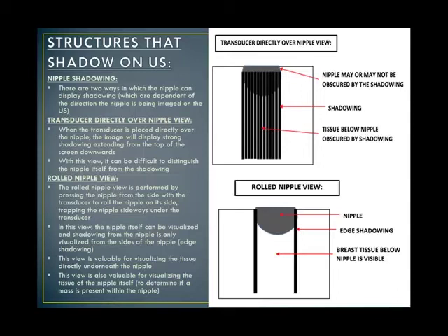So it's always tricky to get around the nipple and see things around the nipple. It takes a lot of practice to figure out how to see things behind the nipple with all the shadowing that occurs back there.